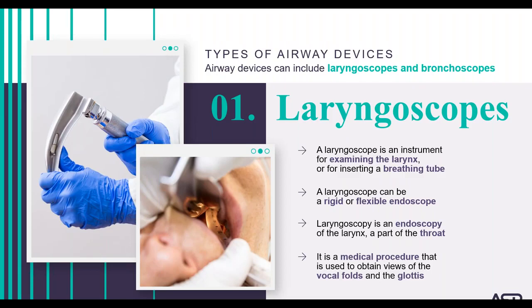When we talk about airway devices, you might think about our current state in COVID-19 and everything we are hearing and reading about in the news, the hospital admissions, the patients in the ICU and on respirators. But while airway devices can assist with life-saving measures like these, they are used for a variety of procedures in assisting with the diagnosis, treatment, and maintenance of airways.